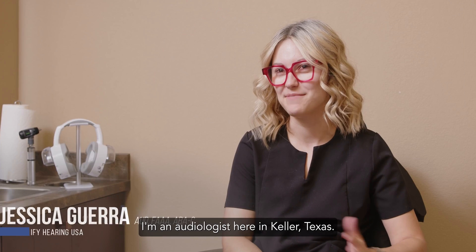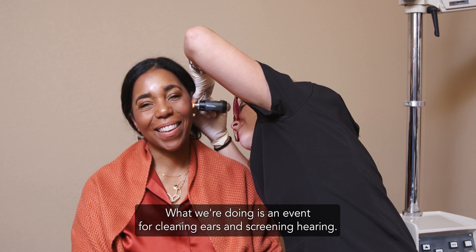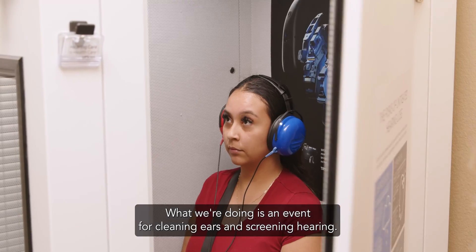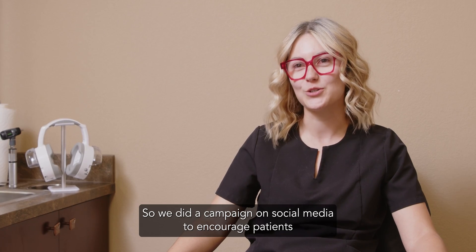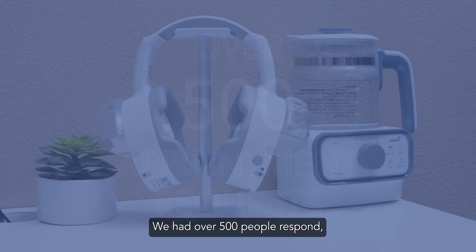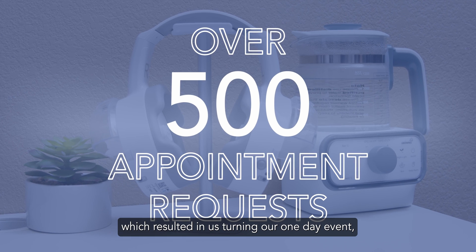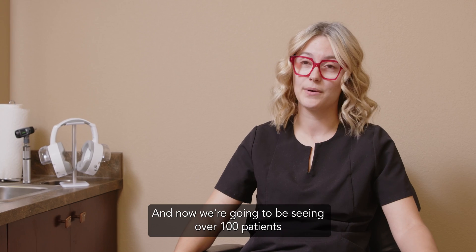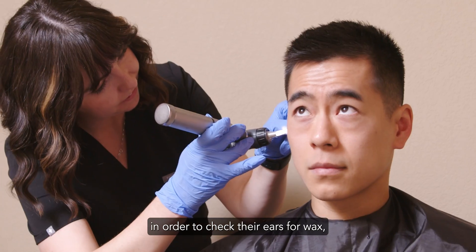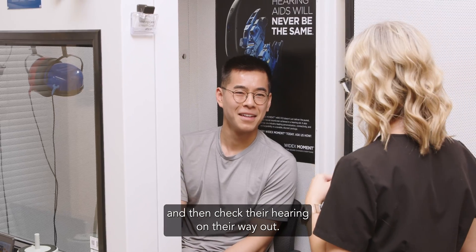My name is Jessica Guerra. I'm an audiologist here in Keller, Texas. Today at Amplify Hearing, what we're doing is an event for cleaning ears and screening hearing. We did a campaign on social media to encourage patients to come to our clinic to get their ears cleaned. We had over 500 people respond, which resulted in us turning our one-day event into a two-day event. Now we're going to be seeing over 100 patients to check their ears for wax, clean them if they need it, and check their hearing on their way out.